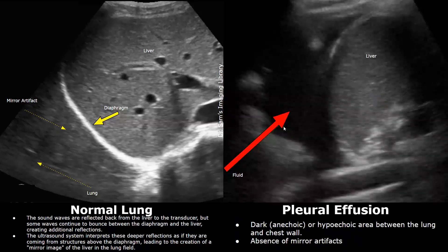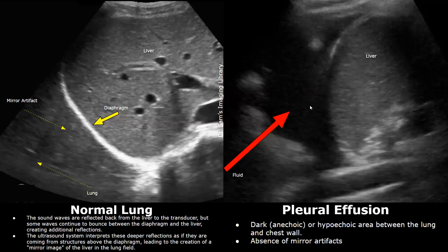This is another case of pleural effusion. Hypoechoic fluid is present in this case, and here a part of the lung is also visible inside the pleural cavity. There is absence of mirror artifacts above the diaphragm. This is the diaphragm and this is the pleural effusion.